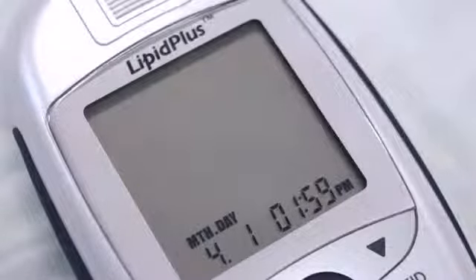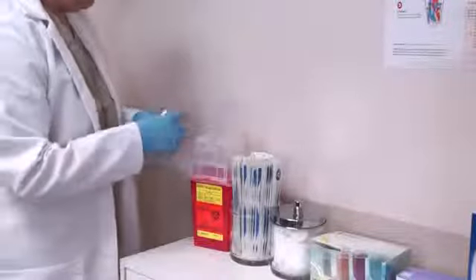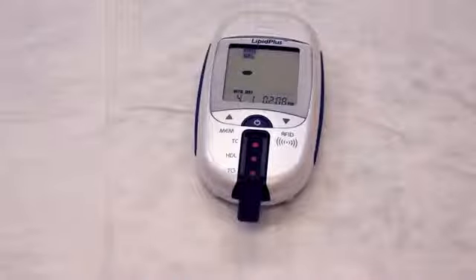You may now remove and dispose of the capillary rod. The analyzer will then begin testing the blood sample. This should take about 2 minutes to complete. After the analysis of the blood has been completed, the results will appear on the analyzer display. If the analyzer is connected to the printer, the results will be printed automatically.